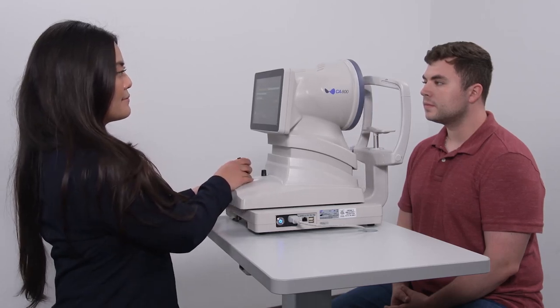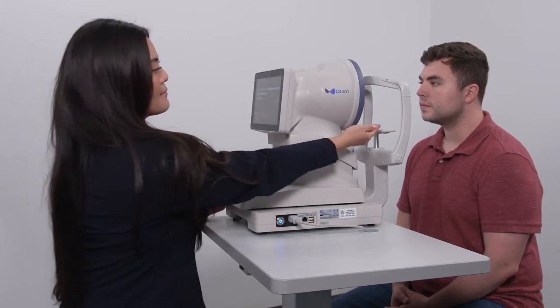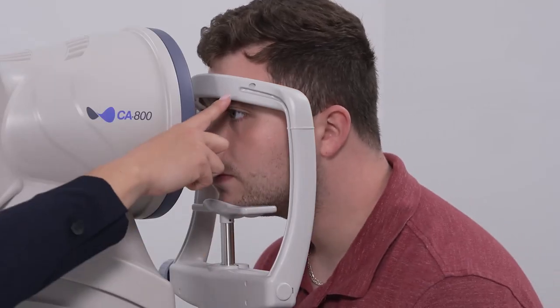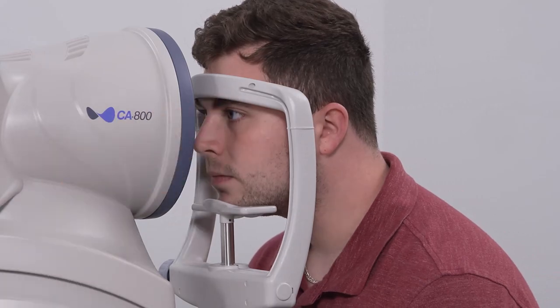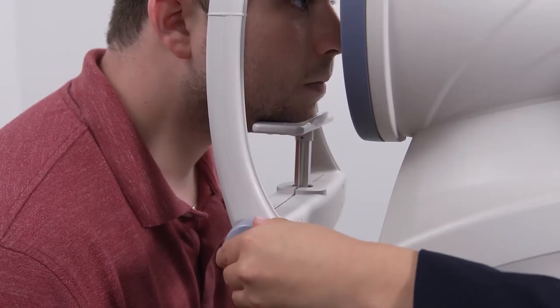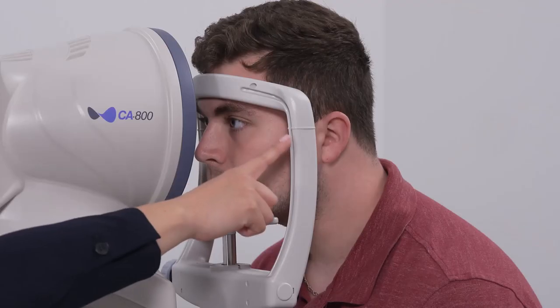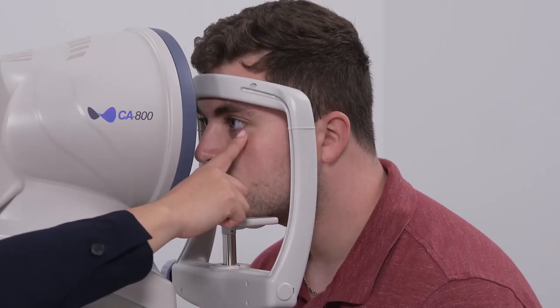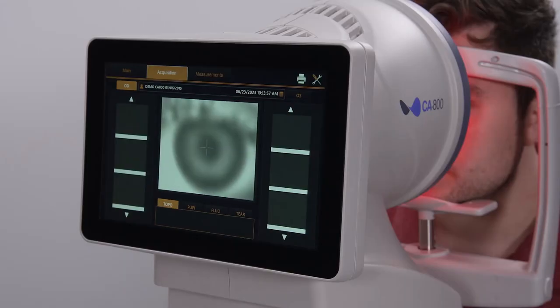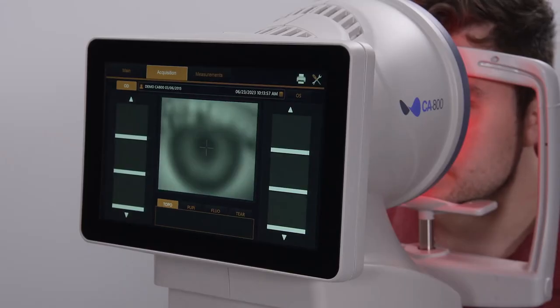Position the patient so they have their chin down and forward in the chin rest and their forehead forward against the forehead rest. Adjust the chin rest height so the eye is aligned with the canthus marker. Adjust the table height as necessary for the patient's back and neck comfort.